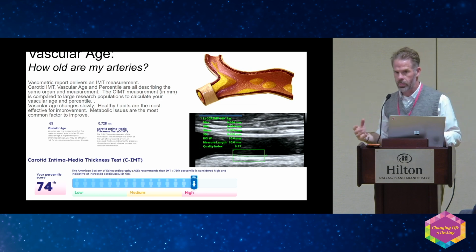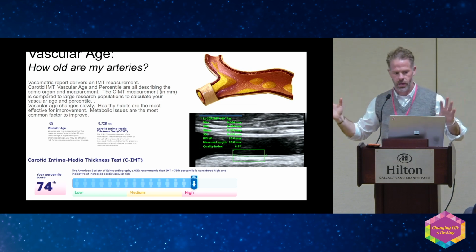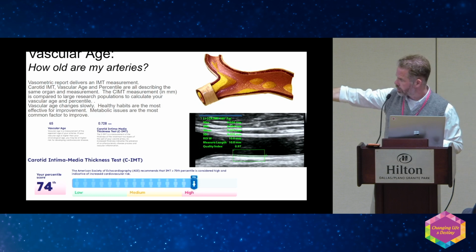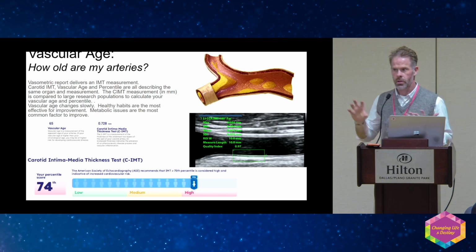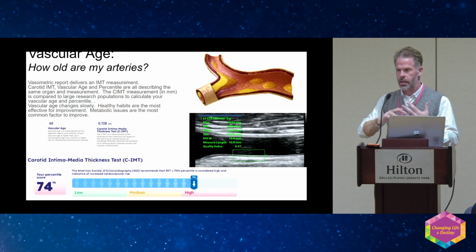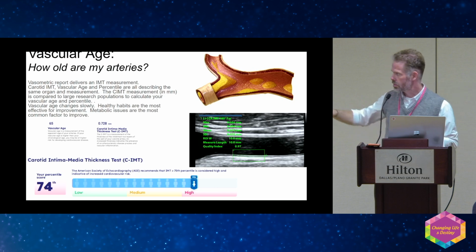I've built a report, I've put it all in sections, and I use references to try to let you know what's normal, what's not. The first thing I look at is that inflammation, the lining of the artery, where that box is measured on the right side. That's intima and media. I give you a measurement in millimeters. Almost always, less than 1 millimeter is how thick that lining is. And I'll give it to you in a vascular age. I'll reference those big research studies so you can see what the measure of inflammation is.